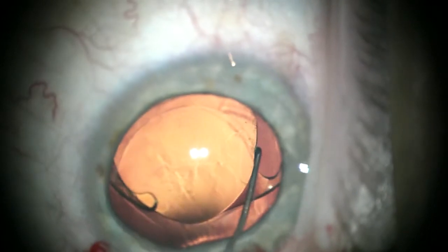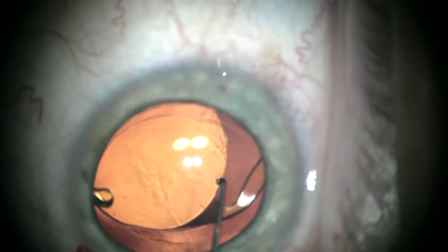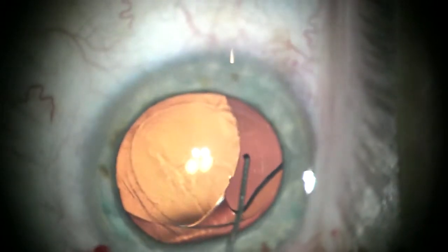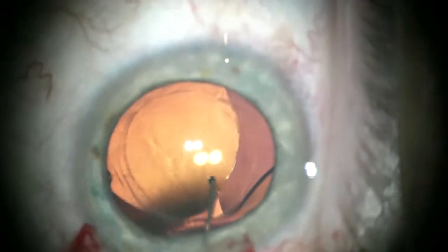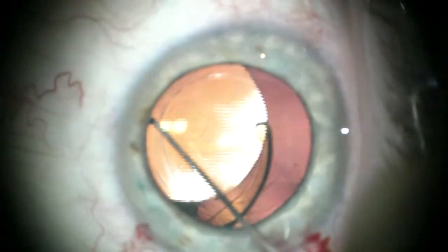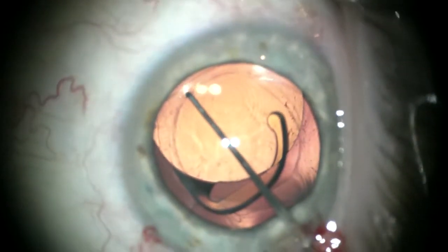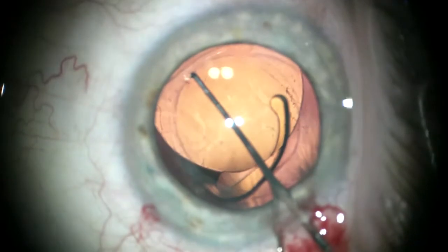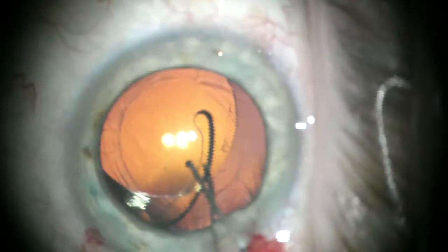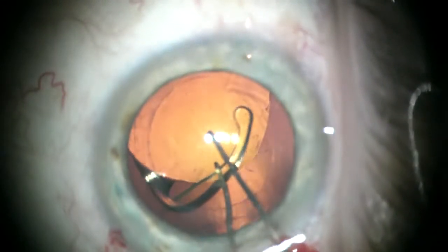I rarely use multifocal lenses because a small percentage of people are unhappy and I don't like any unhappy patients. This patient came to me with a multifocal implant that she was unhappy with, and fortunately it was early enough from surgery that there wasn't any significant fibrosis to trap the haptics in the bag.